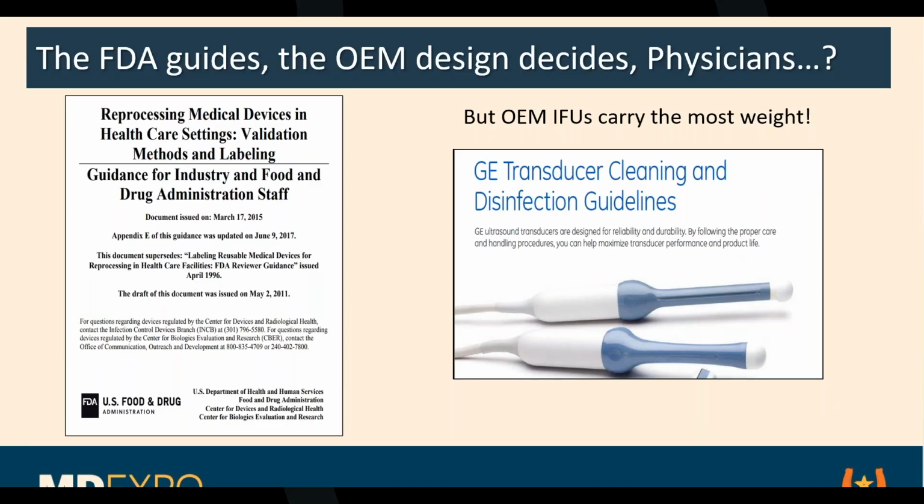It sounds funny, but you use the same chemical. The chemical is cleared for doing something, but once you put it into a tub, it becomes a different device. And then once you put it into an automated thing, it becomes a different device. So the manufacturers of the automated cleaners have to go through a process where they intentionally soil the probes, send them out to a facility that tests for those things, and they have to meet a real high threshold before they can sell their product too. So those things all come together.